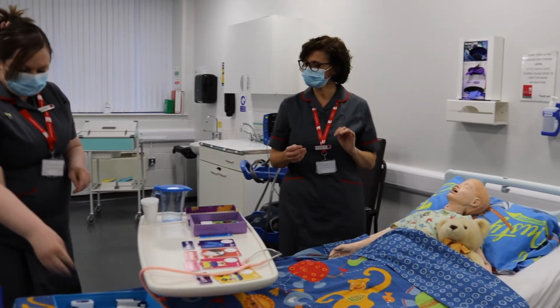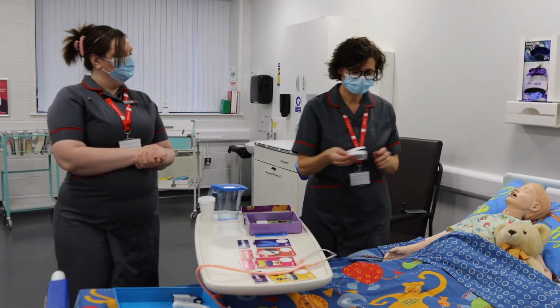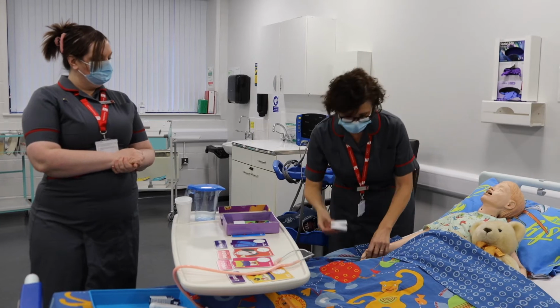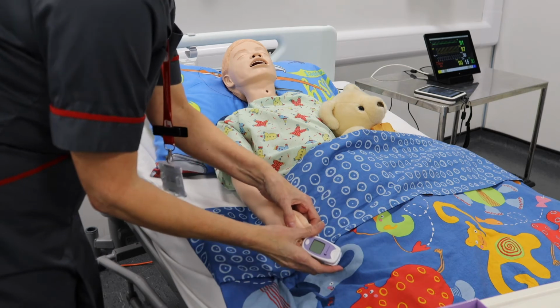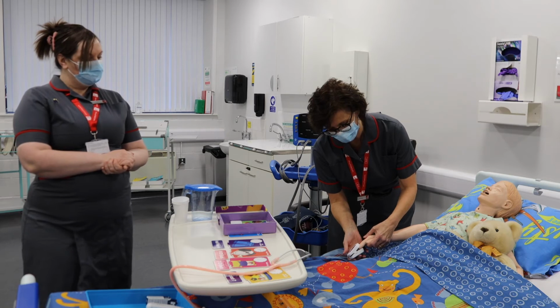Okay, so we could also measure Sam's oxygen saturations if you'd like. Thank you very much. So this is a little piece of equipment that's going to measure Sam's oxygen levels. And I'm going to turn that on and pop it on his finger here. And that will tell me whether or not his oxygen levels are right for him. And they're fine.